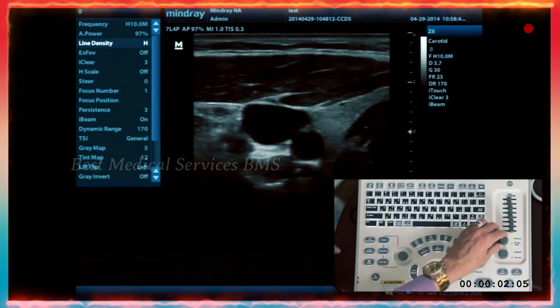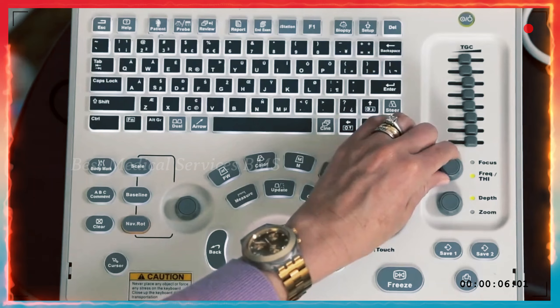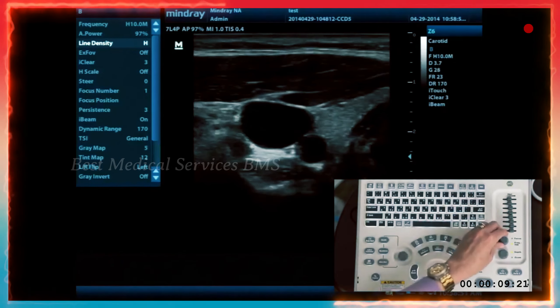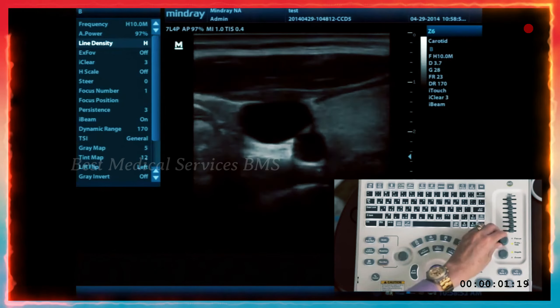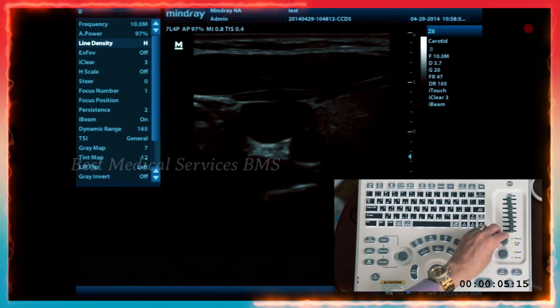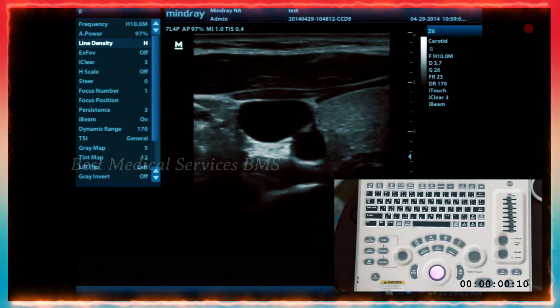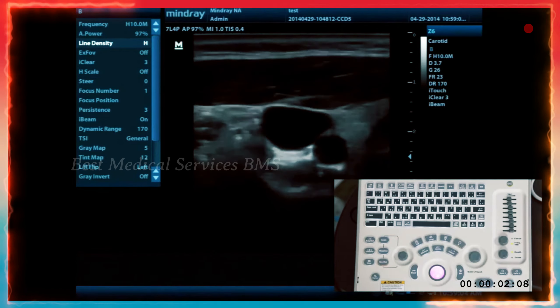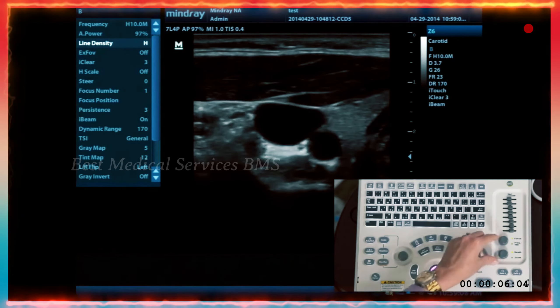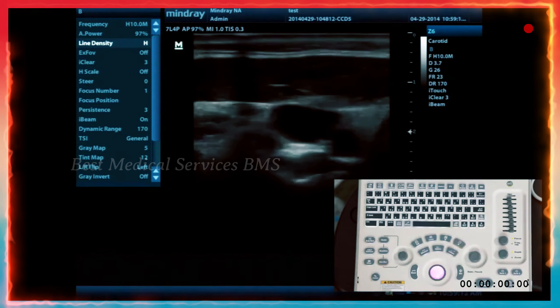If you press on the focus knob, you go to your frequency and THI, which is your harmonics. In that list on the screen you see the frequencies at the top, and as you twist the knob, you go between your fundamental frequencies and your harmonic frequencies. Once you find the frequency you want, press the knob again to go back to focus, since that's something you use more often.